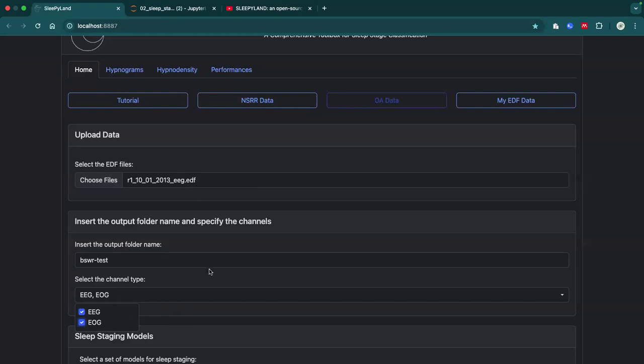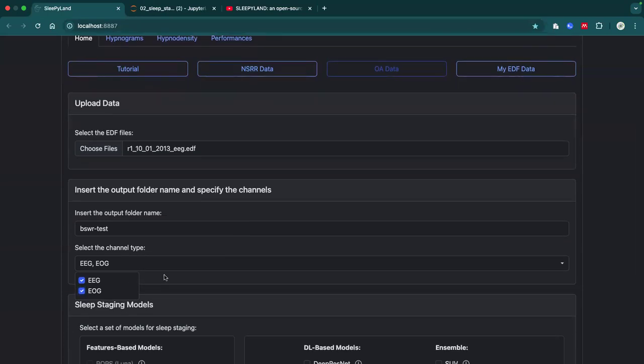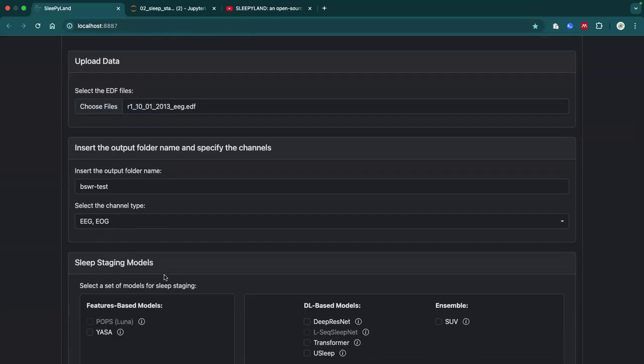So if you have standard channels, for example, 10-20 channel names, standard F3 with mastoids, C3, etc. with mastoids, at that point it's not going to fail because these are the strings that we are expecting from the EDF. But if you have something weird that we didn't know, for example, this EEG channel has been named in another way, it might not recognize it, so it's not going to work, or it's not going to give you some prediction on these channels that you're expecting.